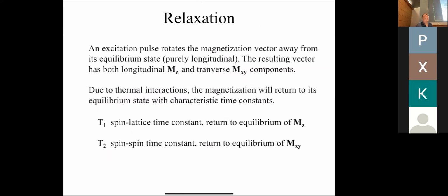Okay, so now we're going to talk about relaxation. And the key to remember is we have to talk about two kinds of relaxation. There's longitudinal relaxation, what happens to the MZ term, and there's transverse, what happens to MXY components. Okay, these are somewhat independent but somewhat related relaxation, so you have to talk about them differently. Okay, but we'll talk later about how they're related. But for now, just assume that you're going to have a longitudinal relaxation that governs how this M sub Z.